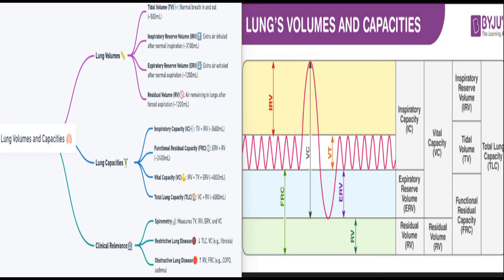So basically, the expiratory limb is the first ascending part of the flow volume loop. It links the maximum TLC, the total lung capacity, and the value of the PEF, the peak expiratory flow. So it depends on the expiratory effort, the velocity and force of the expiratory muscle contraction, the lung elastic recoil and the patency of central airways.